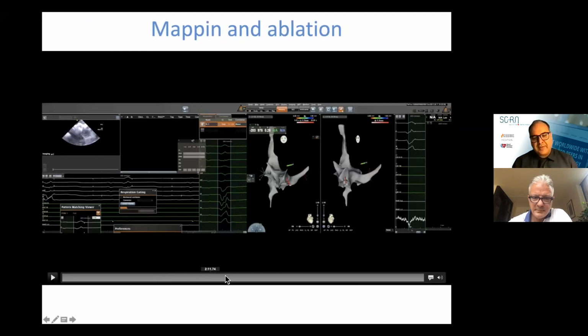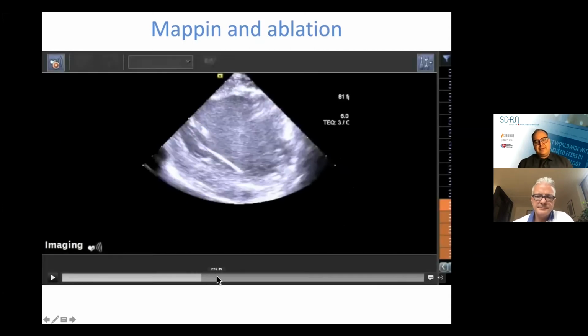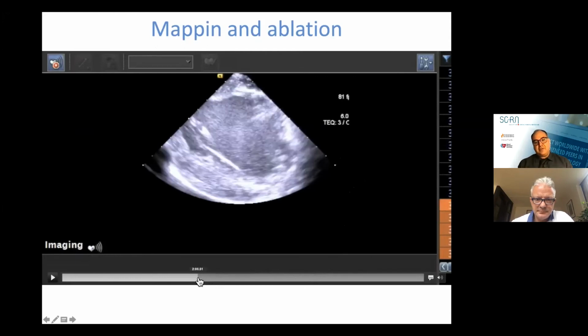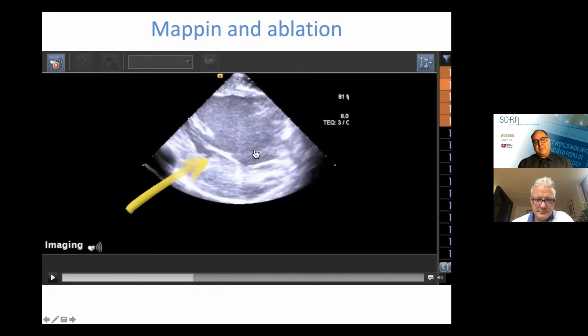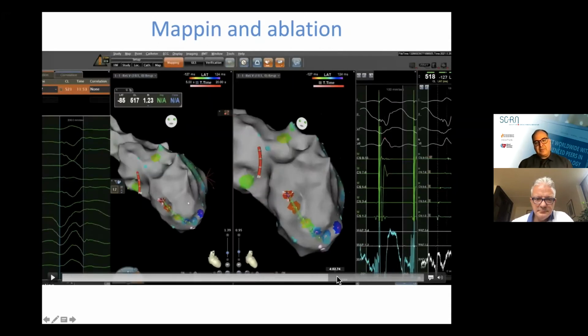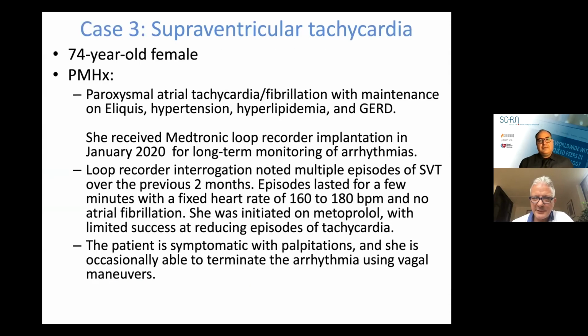Anyway, what I want to show is that it's very difficult to reach. The bend of the catheter is not going to allow you, especially with this large ventricle, to be able to bend it, and the bend will be floating in the ventricle. There's no way that it would reach here. But with RMT, you can do it. And that's what I was doing here. I didn't talk about it, but before starting ablation, I was actually mapping with the RMT catheter. Cool. Okay, let's hear what happened in the third case.